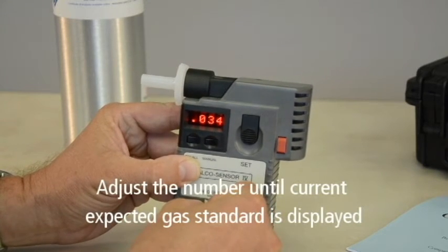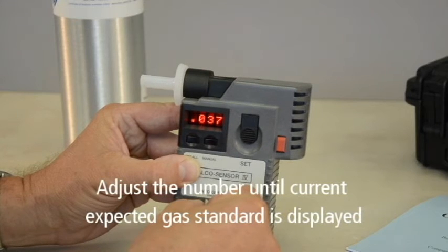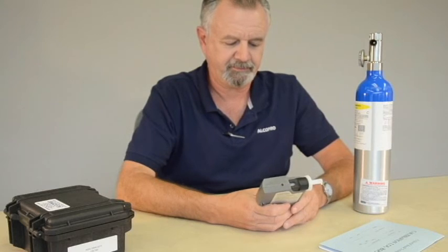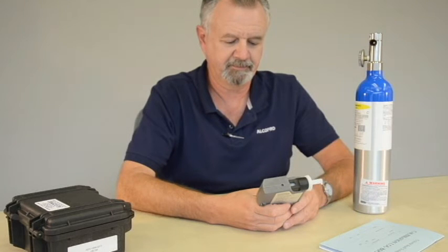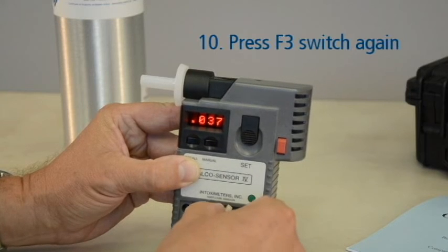Adjust the number until the current expected gas standard is displayed. Once you have obtained the expected gas standard value on the display, press F3 again.